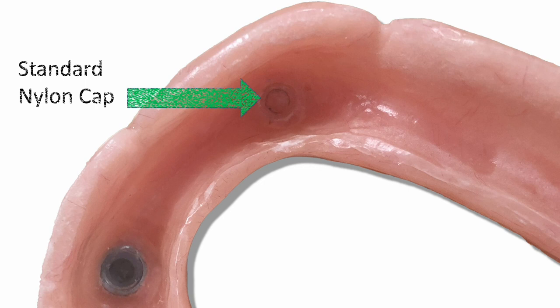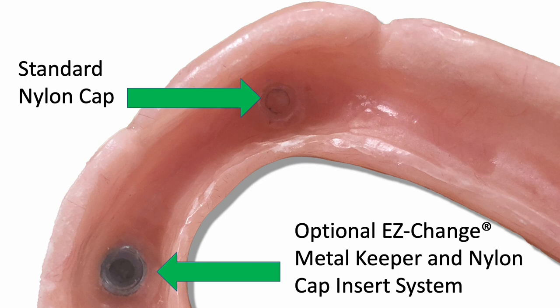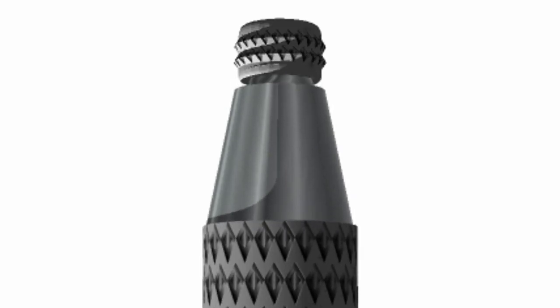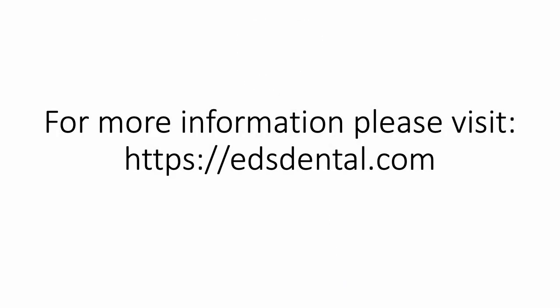Here you can see the final nylon cap incorporated into the denture. Note: the same technique can be used to incorporate the optional easy-change metal housing and screw-in nylon cap insert. When using the optional easy-change attachment caps, upon wear, the dentist can quickly unscrew and replace the nylon inserts in seconds.